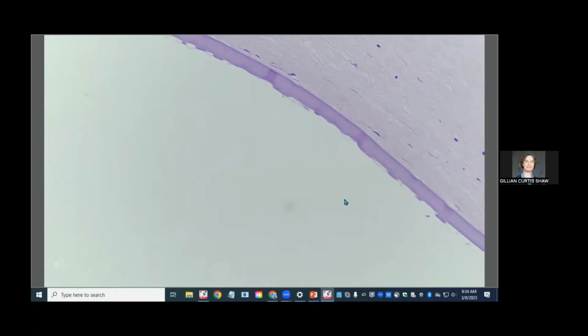That's part of the reason why dystrophies like this can end up in really severe corneal hydrops, because you lose that active pumping of the fluid out of the stroma with a dystrophic endothelium. It's crazy to think that those endothelial cells can manage to keep the entire cornea dehydrated because it's so thick. Are they basically creating a gradient? Yeah, it's a sodium potassium pump type action. That's crazy, a sodium potassium pump. Yep, they are small but mighty and beautiful.